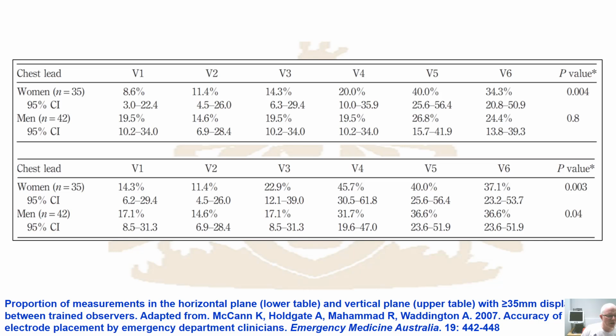So in other words, when you're testing males and females, and of course you can understand why there are differences between getting those electrodes placed in males and females, and why there might be greater variance in females than males, because of the fact that we've got the mammary glands which are in the way, and therefore it makes it much harder to identify those key regions. It is much harder to collect these in females. So again, you can understand how our signal now starts to become so fundamentally determined by the accuracy of the placement of those electrodes.